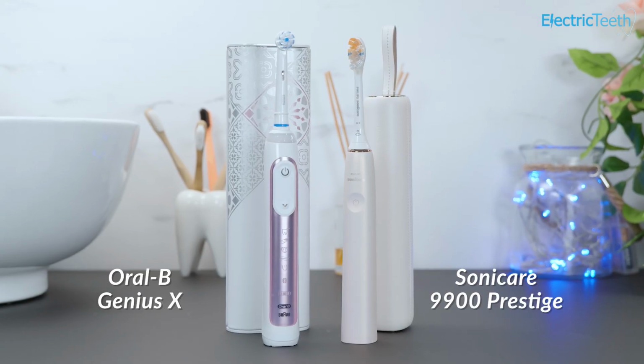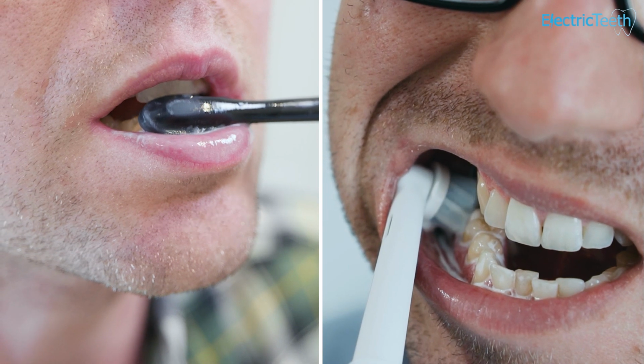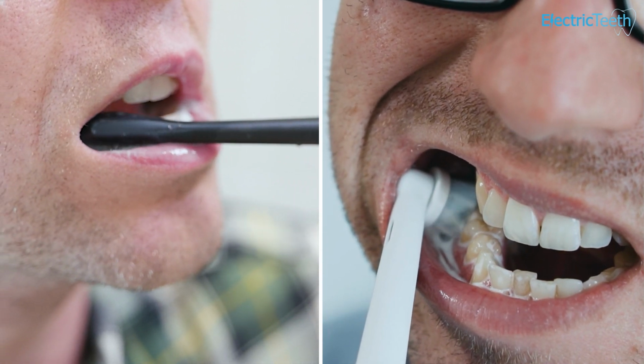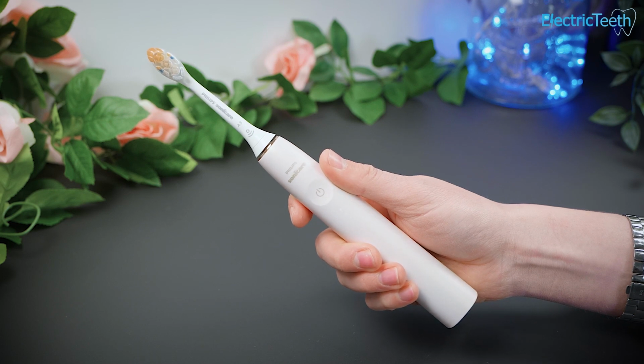Before I give you my overall recommendation and explanation as to why, I want you to know that as important, if not more important, than picking one particular toothbrush is making sure that you're brushing with the correct technique, brushing twice a day, brushing for 2 minutes, and cleaning in between your teeth as well. If you perfect these things, it is likely that you're going to have a bigger and more positive impact on your oral health than picking any one particular electric toothbrush.